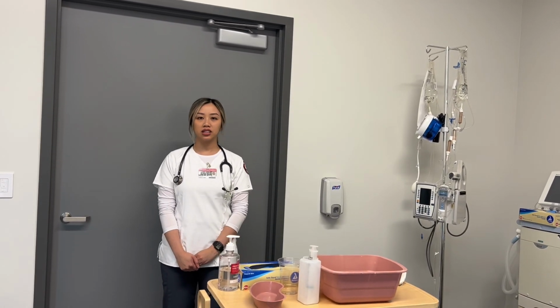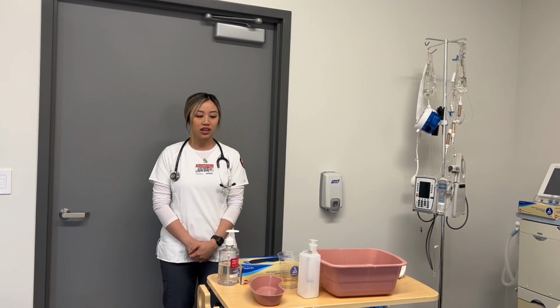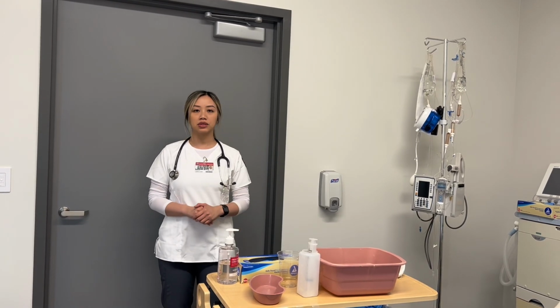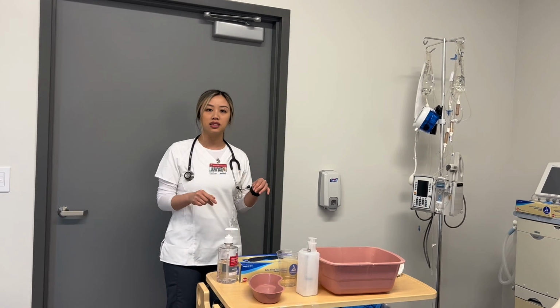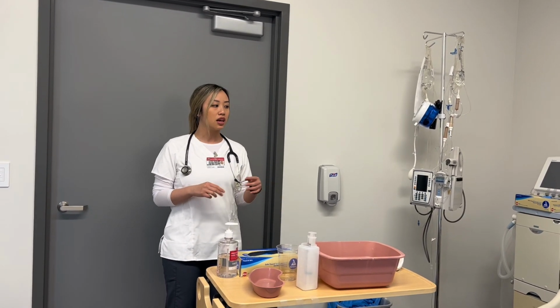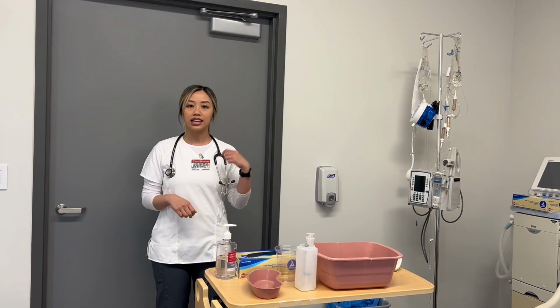Alicia. So today I'm going to perform an NG tube placement for a competency video. First and foremost, I'm going to check the computer, making sure to verify the process and see the doctor's order for the NG tube placement. I'm seeing that an NG tube needs to be placed because the patient hasn't really been eating and has had difficulty getting his meds.